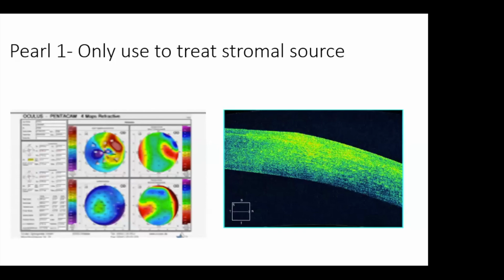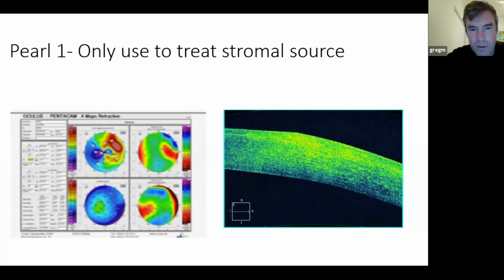I'm asked, "Do you think this might be something that would be good for an IC8 lens?" The first point I'd make about the IC8 lens is I hope this doesn't become a solution to any irregularity in the cornea when in fact there's a better solution to treating irregular astigmatism in the cornea. And this was a post-pterygium patient who had developed some pre-Bowman's scarring.